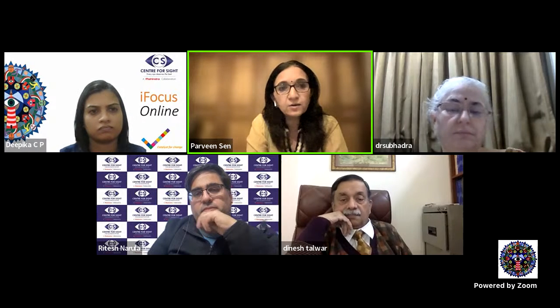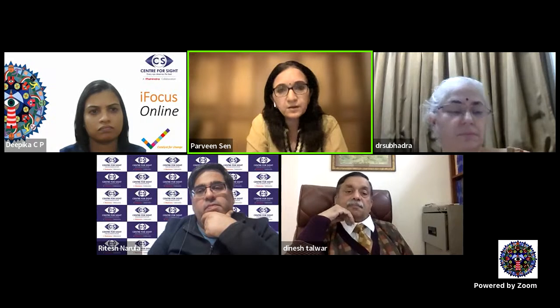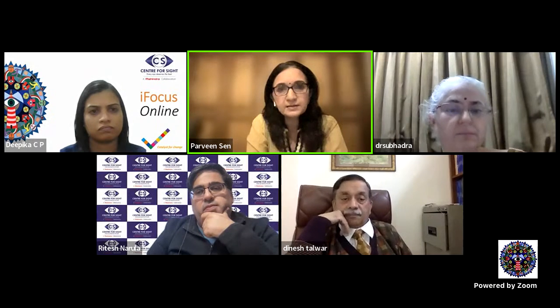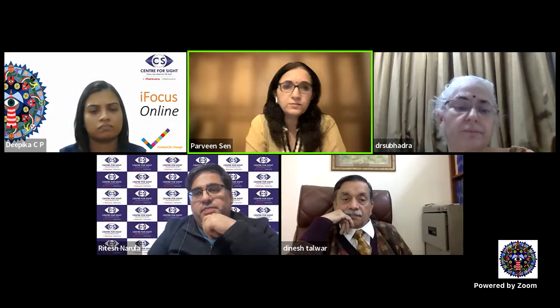And the loss in the foveal peak may not be due to the surgery, but because siderosis can progress even after removal of the intraocular foreign body. So this could probably explain. I would say that you doing multifocal ERG is good, but please do full field ERG also. I'm sure you'll find that also equally affected.